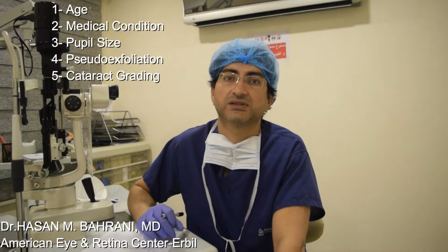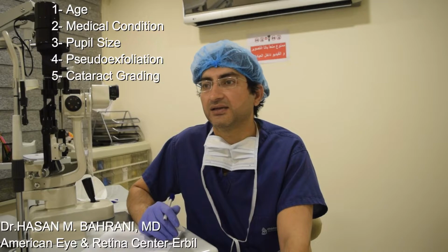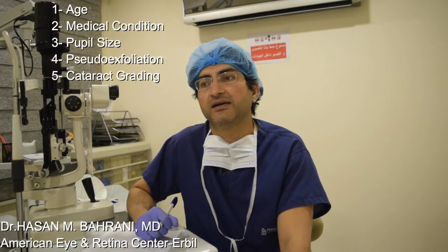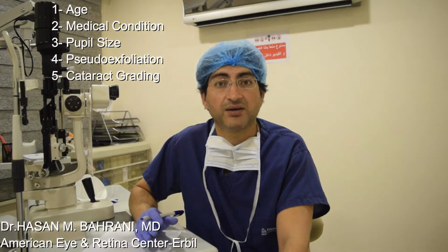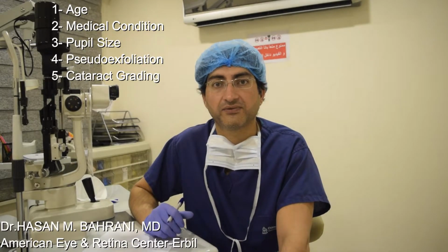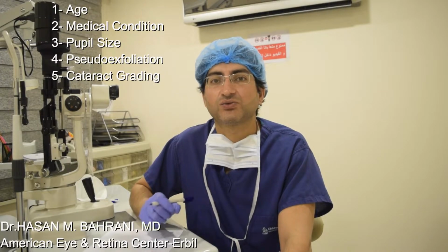Pseudoexfoliation surgeries look easy, they look fine, but intraoperatively they behave totally different. I have many cases where I felt like I'm doing fine, I got the cataract out, and I'm ready to do the IA, and everything is going well, and then you hit a problem while doing the IA, or irrigation aspiration. Actually most of my trouble with pseudoexfoliation happens at the end when you're trying to do irrigation and aspiration, because that's when you get in trouble.